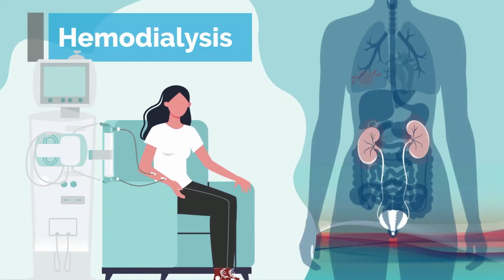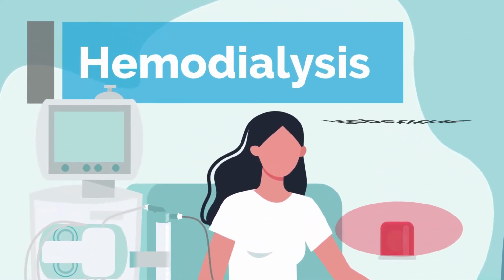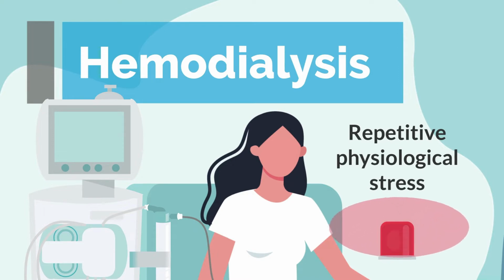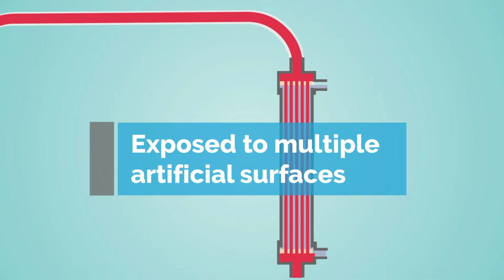Hemodialysis is a life-sustaining therapy for patients suffering from end-stage kidney disease. However, hemodialysis also means repetitive physiological stress for patients. As blood and its constituents leave the patient's body to circulate through the extracorporeal circuit of the dialyzer, they are exposed to multiple artificial surfaces.